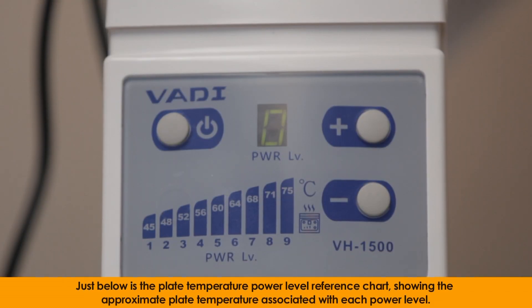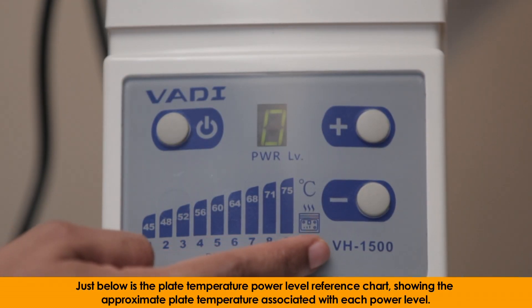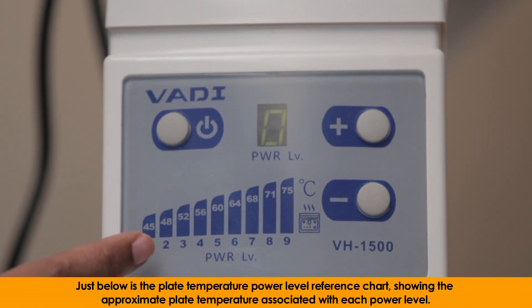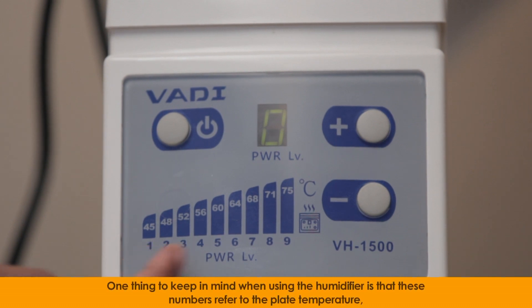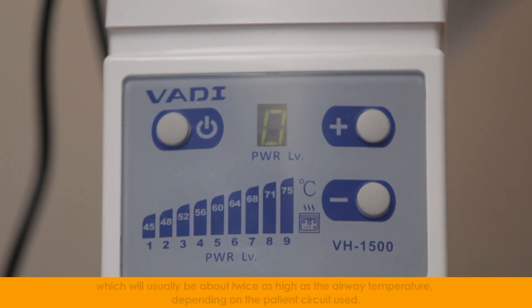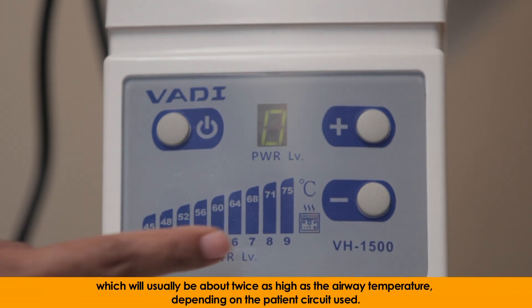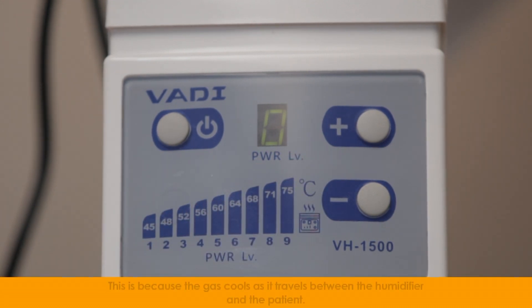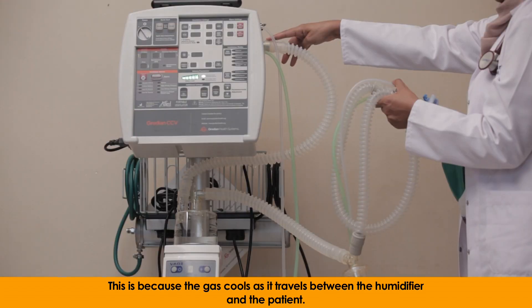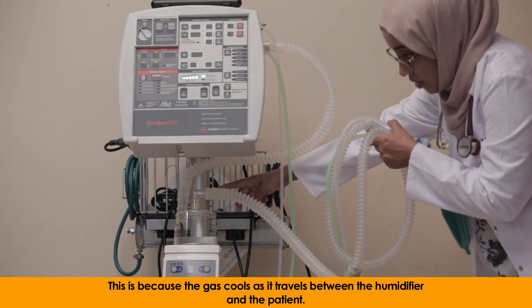Just below is the plate temperature power level reference chart showing the approximate plate temperature associated with each power level. The temperatures are listed in degrees Celsius. One thing to keep in mind is that these numbers refer to the plate temperature, which will usually be about twice as high as the airway temperature, depending on the patient circuit used. This is because the gas cools as it travels between the humidifier and the patient.